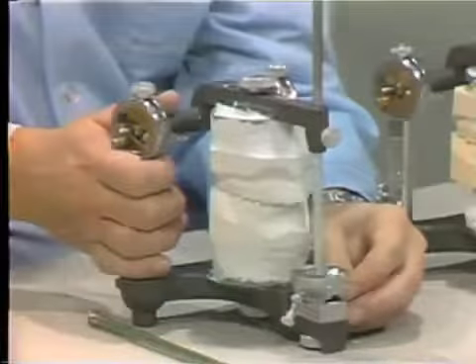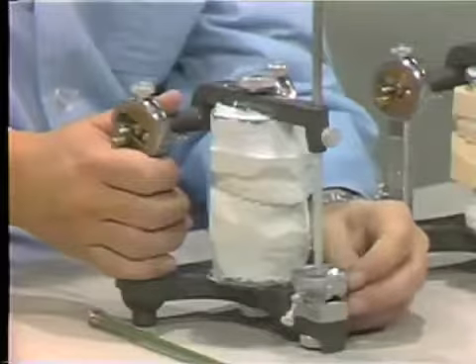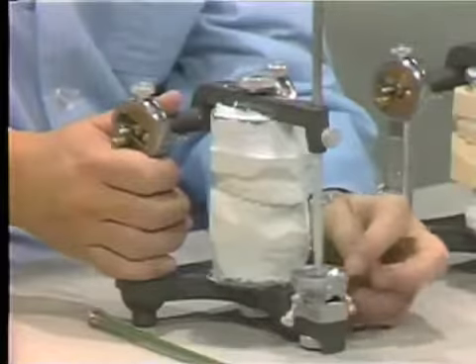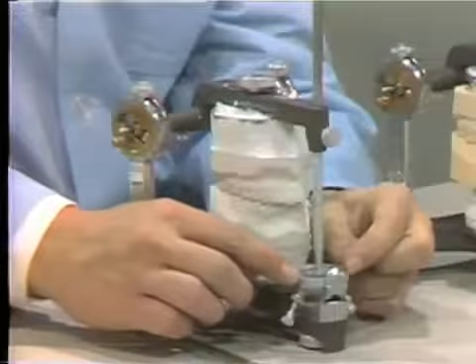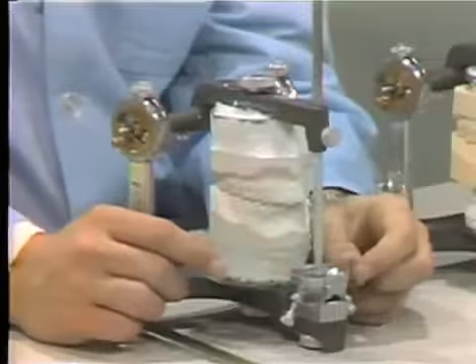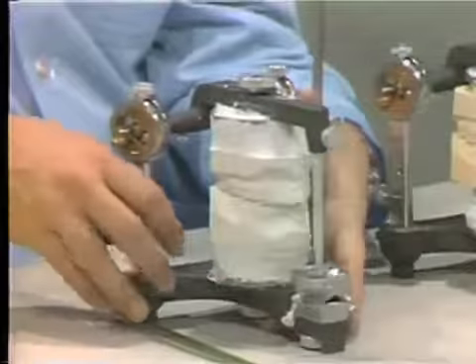About 99% of the time in the lateral excursions, we can duplicate or simulate the lateral excursions by raising the lateral wings of the incisal guide table. However, in the protrusive excursion, it is sometimes difficult.